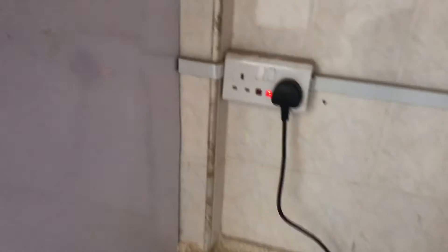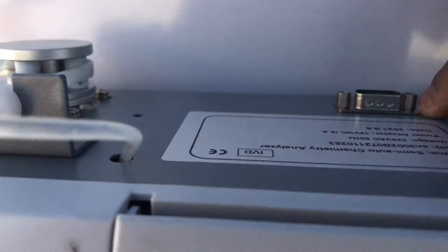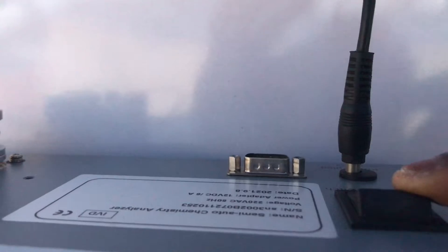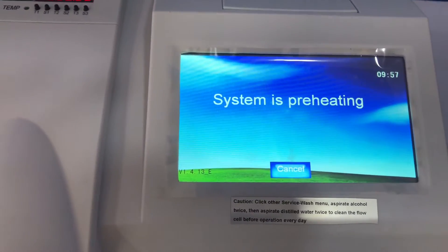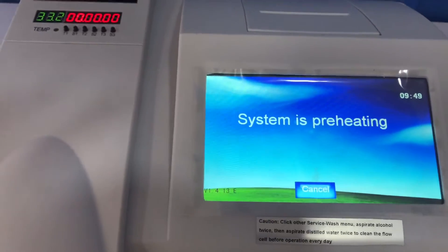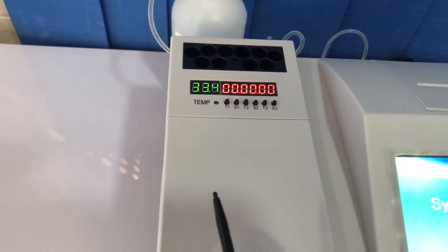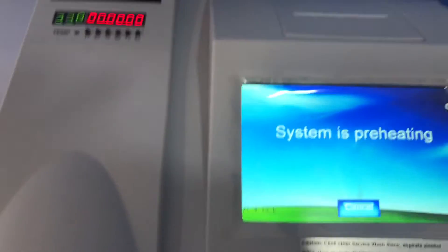You have your aspirating button and your flow cell tube. I'll put it on now. The power button is at the back. When you power it on, it enters preheating mode and will preheat for 10 minutes up to 37 degrees Celsius, which will be displayed on screen. There's also an RS-232 port at the back so you can connect it to a computer.